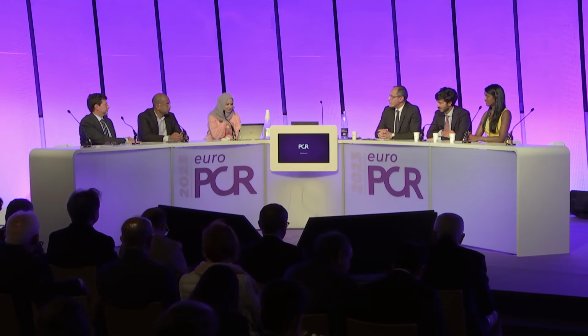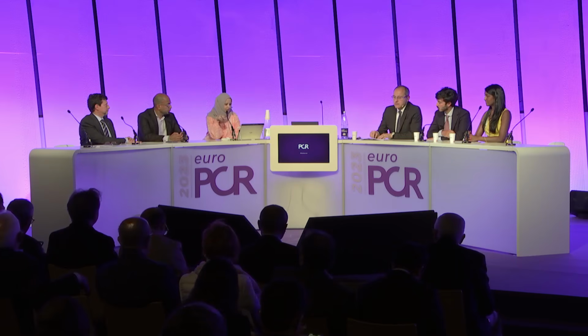Midvat, any comment or questions from the chat? Well, a couple of questions really related to wire trapping and protecting side branch again when you're rotablating, but really trapping wires in side branches in calcified lesions or jailed wire technique.